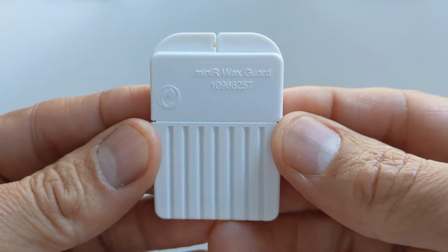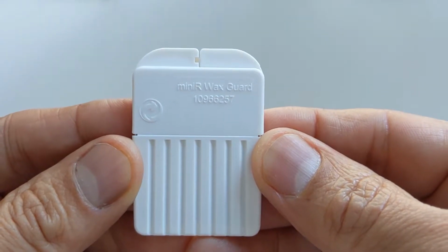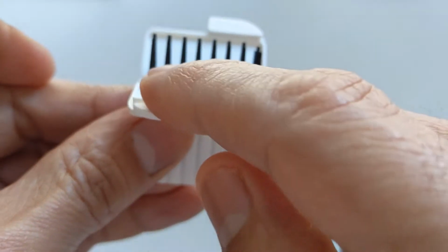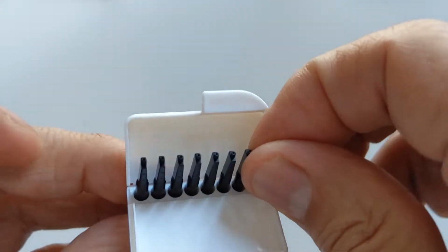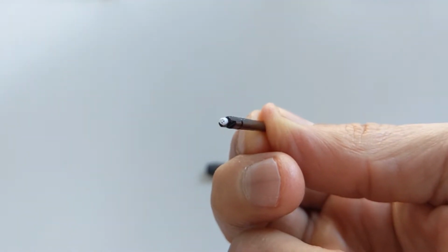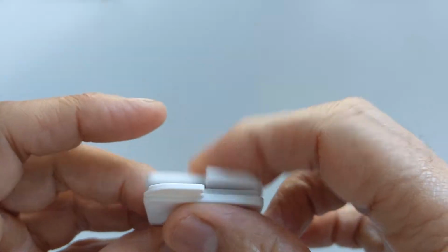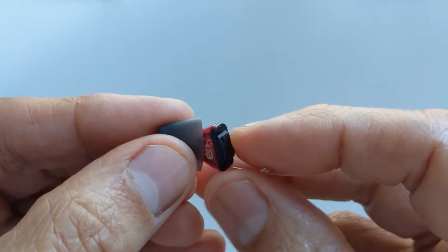Today I'm going to show you how to change the miniR wax guards on the Signia Silk. If we open this up, you'll see that there are 8 individual sticks inside, and on the end of each stick is a wax guard that looks like that. So we'll just put that back in there for now.